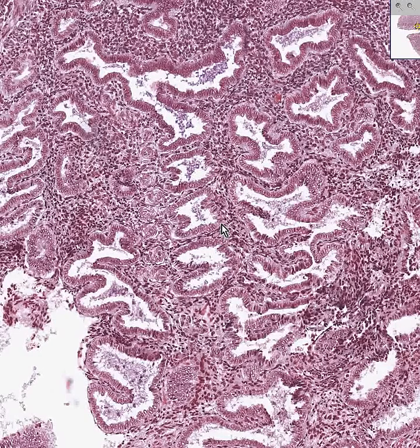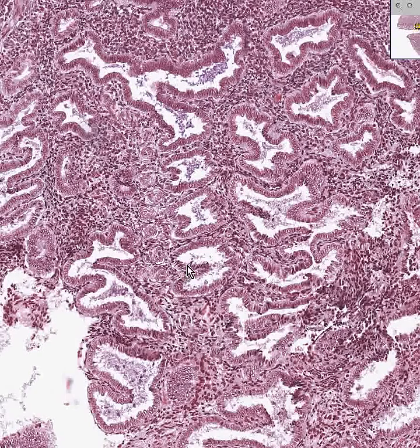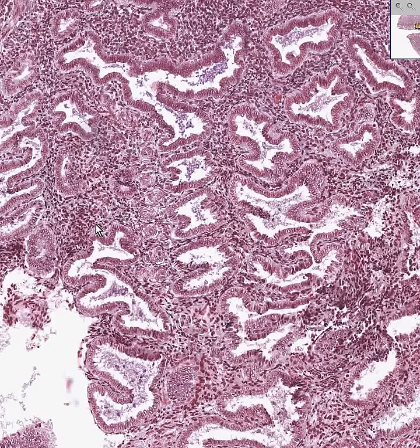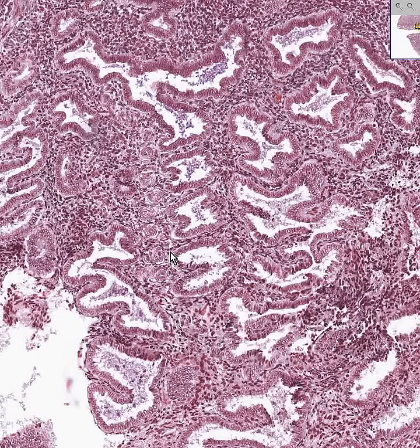Eventually, towards the end of the secretory period, there will be little sheets of decidual-looking cells here, which we don't see, and infiltration of neutrophils because the tissue is now sloughing to become a menstrual endometrium.